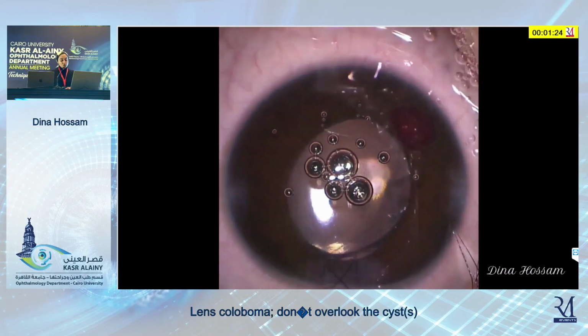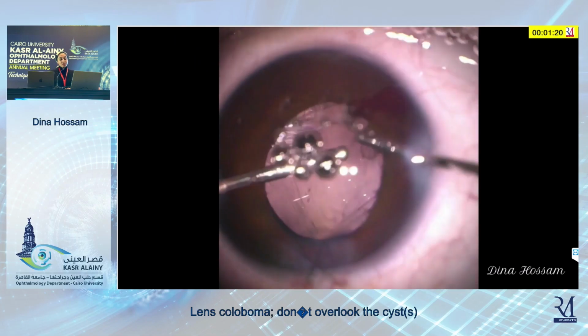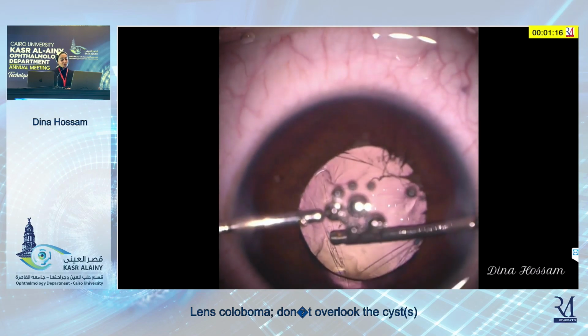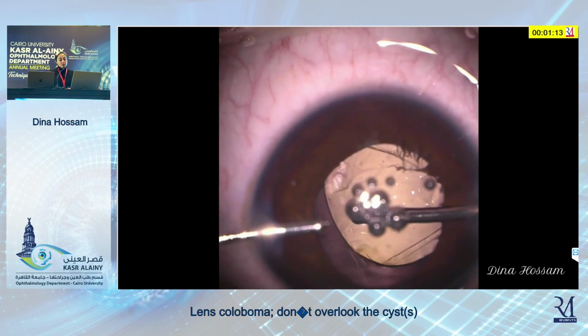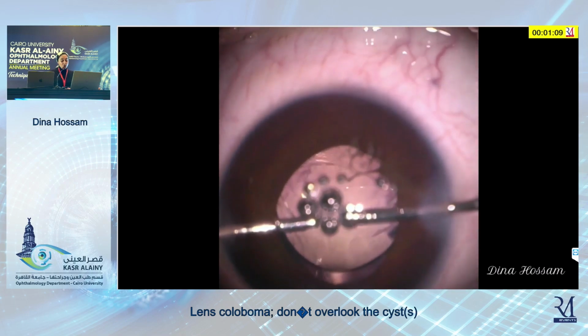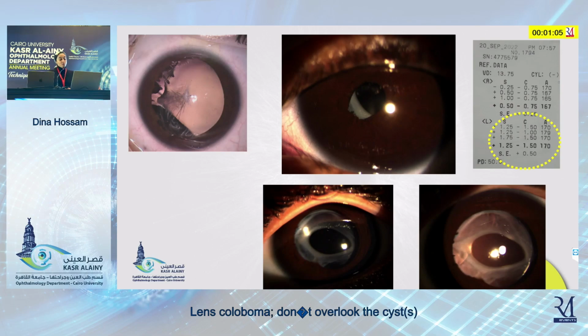And at the end of the surgery, just this microhyphema from the small vessels could be easily aspirated, but you should be also prepared with endodiathermy. Here I also captured the optic behind the posterior capsule to have a complete optic capture, and this was at the conclusion of surgery. And this is the post-operative pictures, dilated and undilated, with the exact intended target refraction of +1/2.